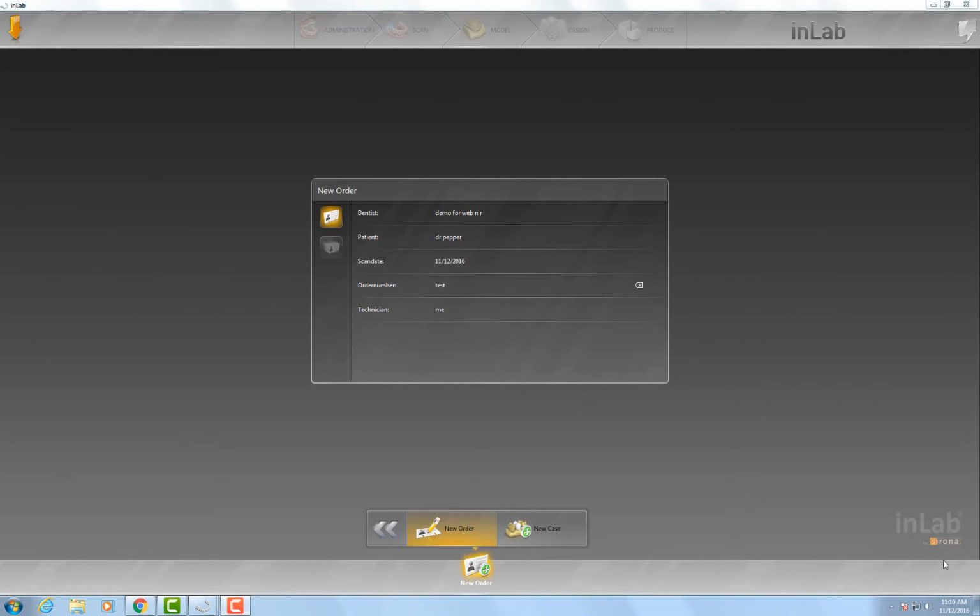One thing we are really experiencing in our lab is a huge growth in our market, especially in the removable department. First, to give you a little background on me and why we're experiencing this growth: my main role in this lab as lab manager is to find out how to manage efficiency in our laboratory. Originally, I come from a fixed background. I really didn't have any background in the removable department as of 2 years ago.